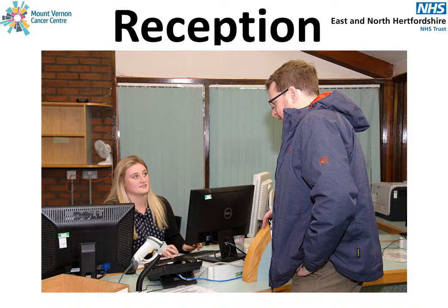We would ask you to arrive 1 hour before your planning appointment. Please check in at the reception desk and have a seat in the main waiting room. A member of the radiotherapy team will call you into a private room and explain what will happen during your appointment. You will be asked to try and empty your bowels and your bladder before your scan.